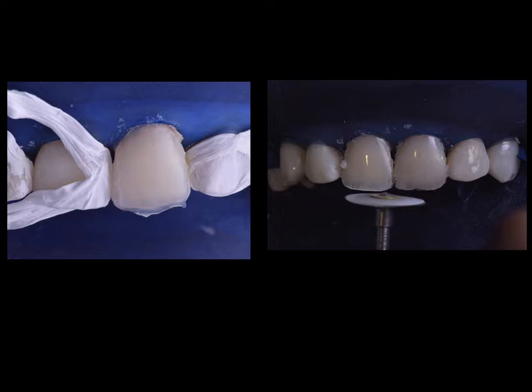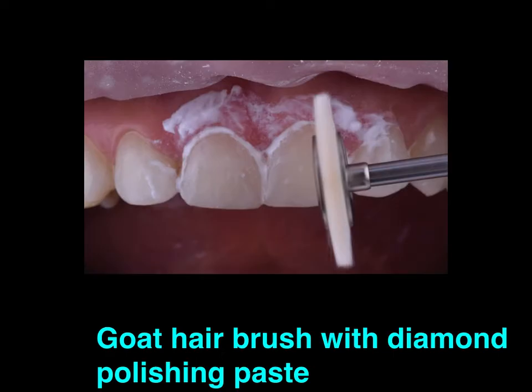You will use any discs that you have, any polishing disc for the incisal area. You can use the goat hair brush with a diamond polishing paste just for the final. Do not touch the gloss. You will have a glossy area. This is just to give it a little bit more finish, which in many cases you don't really even need to do. And that is the final restoration.